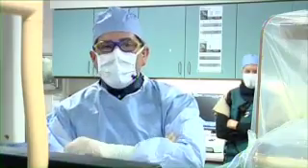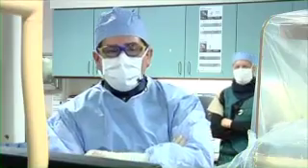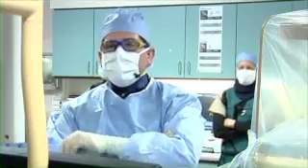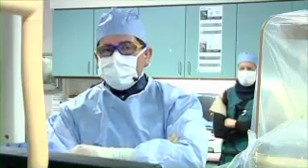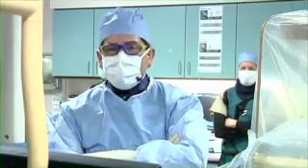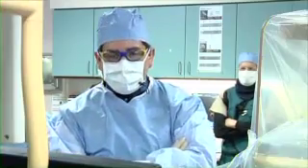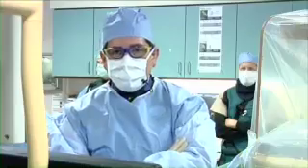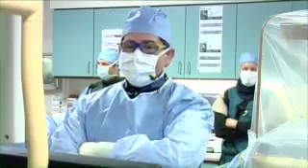That's why when we do these procedures, you have to make sure that the patient needs the procedure to be done. So indication is very important. That's why we don't close everybody. Number one, this is an invasive procedure and it needs the respect of being an invasive procedure. One more question, then I want to see you release that disc.